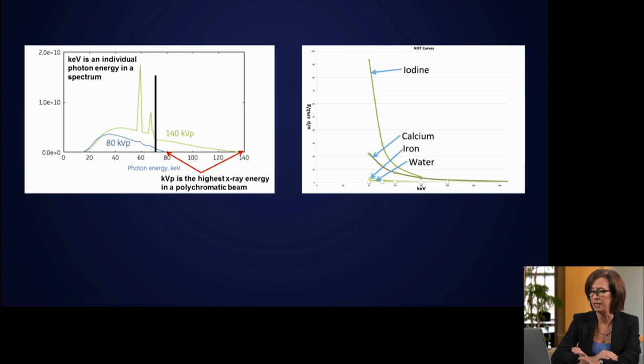Now with dual energy CT, one of the basic principles you need to remember is, unlike single energy CT, where the degree of density or the brightness on the image is due to physical density alone, with dual energy CT, because we're sending the two beams through the patient, we're looking at the attenuation of various materials at high and low energies. And it's actually the difference in attenuation between high and low energy that determines what the material is.